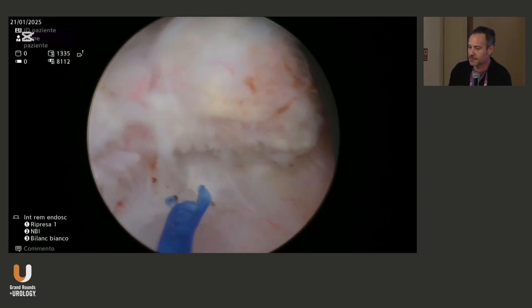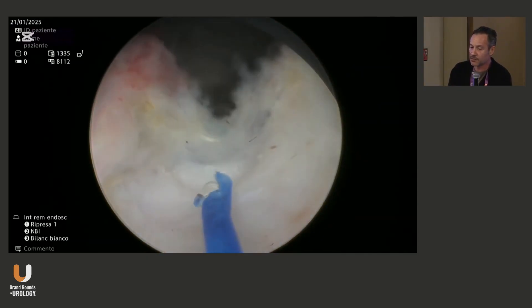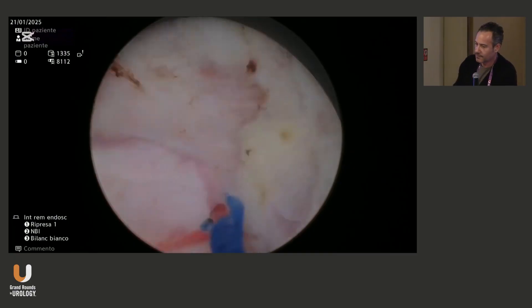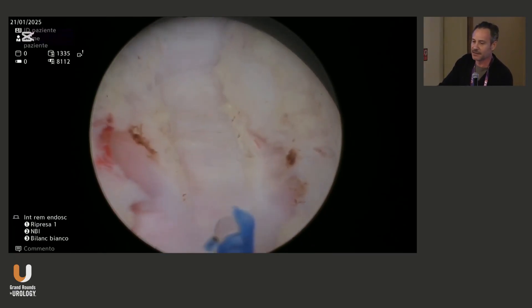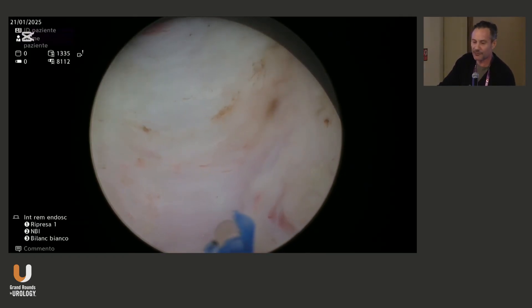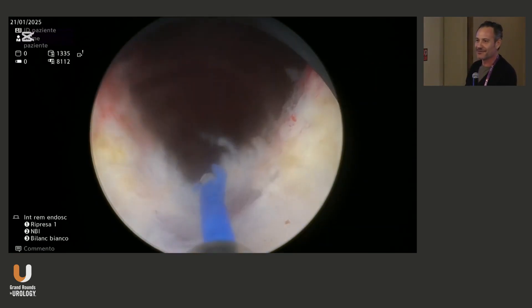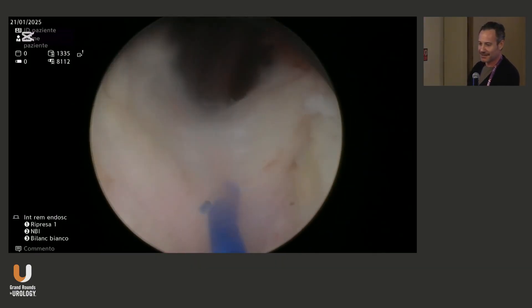Again, we create space between the lobes. The flow increases and the visualization is always pretty clear. I didn't cut the procedure — you may see it's a pretty fast procedure. This is the kind of procedure I like; I also do a lot of robotic surgery, but this is always a challenge I have every day: am I able to find the right plane today? Let's see what's going on.